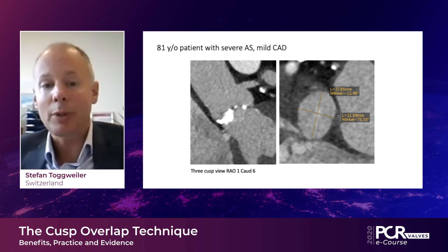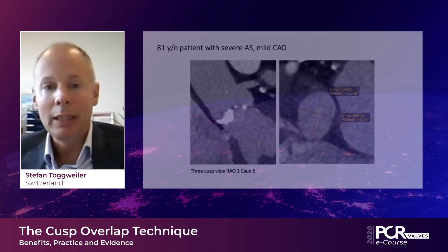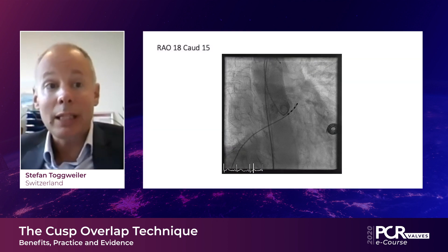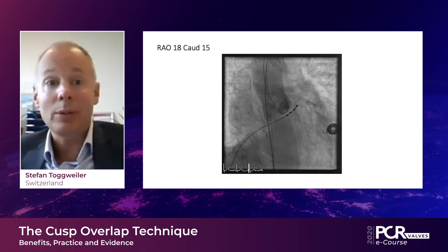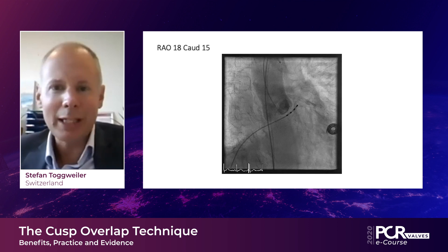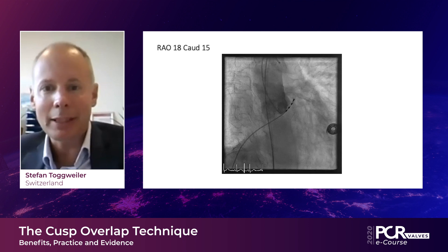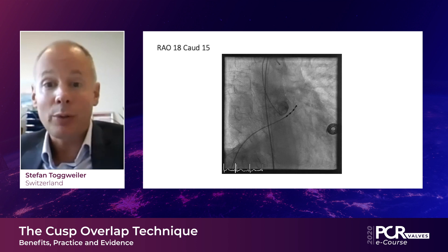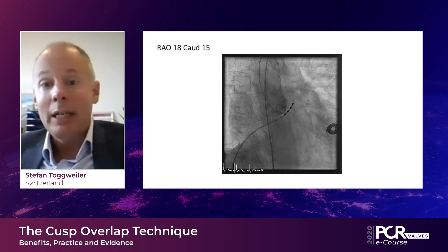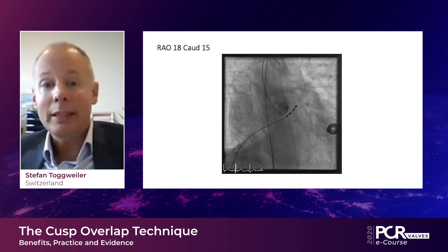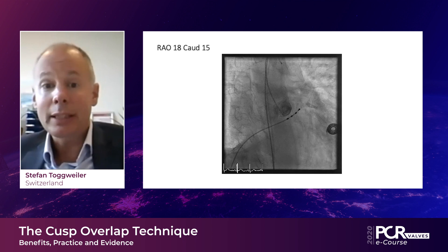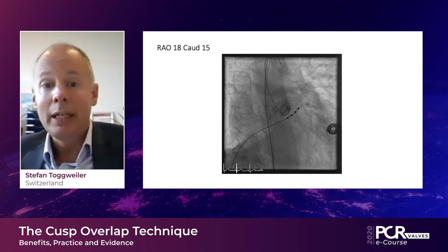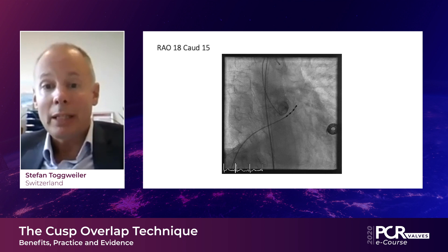So to reach the cusp overlap view, we have to go more RAO-caudal. This is how it looks when we go RAO 18, caudal 15. As you can see, the pacemaker wire is a little bit dislodged on this image, but it doesn't matter. What you can see here is that we don't have a perfect overlap, but it's very close. And already we are isolating the non-coronary cusp on the left side of the screen, and we are opening up the LVOT.